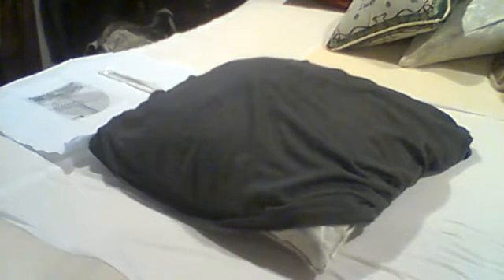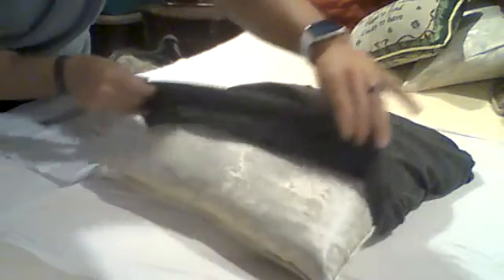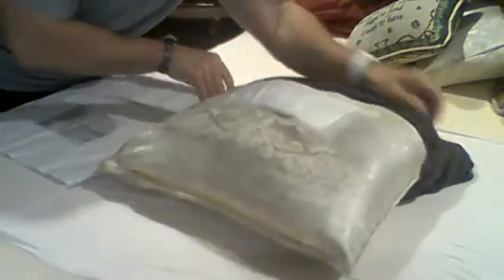The next thing that I'm going to do is go ahead and don clean gloves. But I'd like to do hand hygiene one more time real quick before I don my gloves. So hand hygiene, wash my hands. I don't have any exam gloves here, so in an actual setting I would have on exam gloves. So the next thing that I'm going to do is go ahead and expose my patient's site. So there's my patient's site right there.